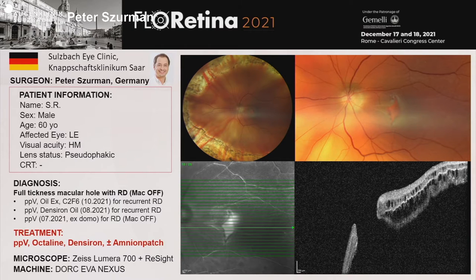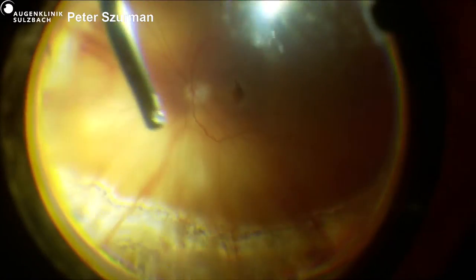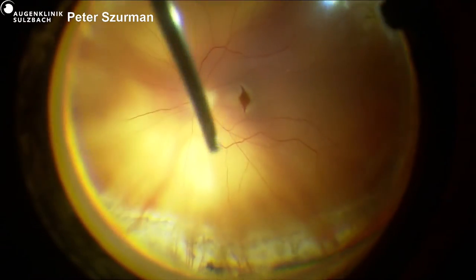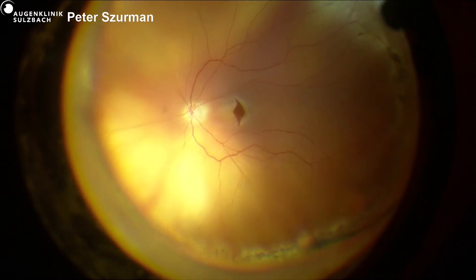He has been operated externally in a private practice setting for retinal detachment and had re-detachment for PVR, silicone oil surgery. And after silicone oil release, we have found this situation. So we have a good peripheral laser circlage, but we have a small PVR layer on the retina and this macular hole.